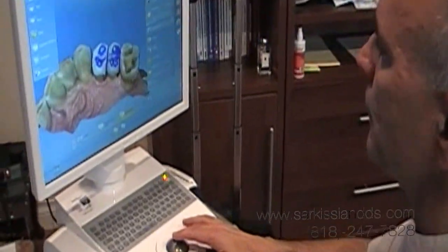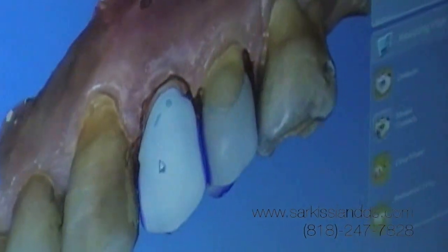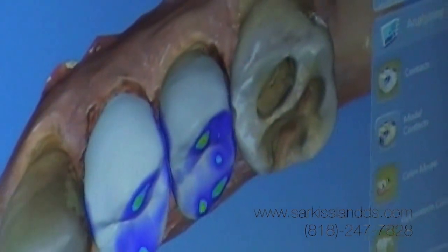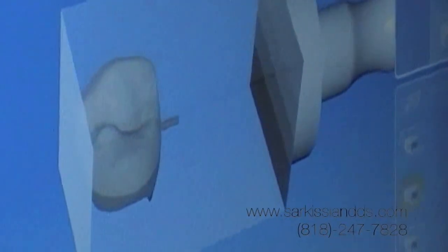Just finishing designing on the CEREC software two onlays. One is a little more like a crown, so we're going to use a layered porcelain. We will be sending it to the milling machine wirelessly so it can be milled out of a single block.